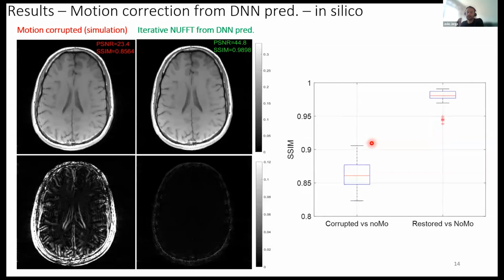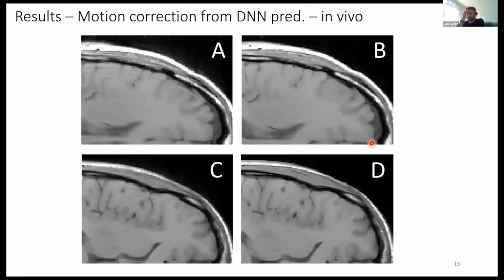Okay, but as a suggestion, you could simulate it and see the effects more systematically if you wish. Otherwise, it's really nice work, and I think it's a really important thing to look into for these imaging applications. One other question: your use of eSPIRiT. Based on the discussion with Ileana, you mentioned there's no acceleration, so you're using it just to get the underlying image from all the coil combination. Yes, exactly. It's the sum of squares.